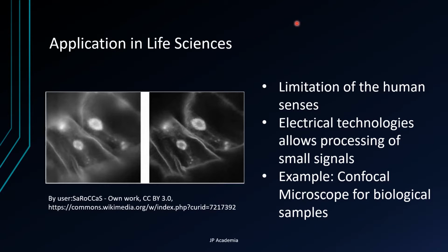Through the development of electrical technology, we were able to detect very small signals that improves our research capabilities, aids our senses, and improves the accuracy of medical diagnosis and treatment. In the picture, we have a biological sample acquired using confocal microscope. Confocal microscope is an instrument that provides a high-resolution image with all the areas in focus throughout its field of view, even for a sample having dents or damages on the surfaces. They enable the non-contact, non-destructive measurement of three-dimensional shapes.